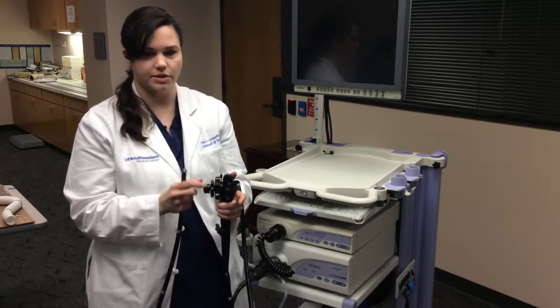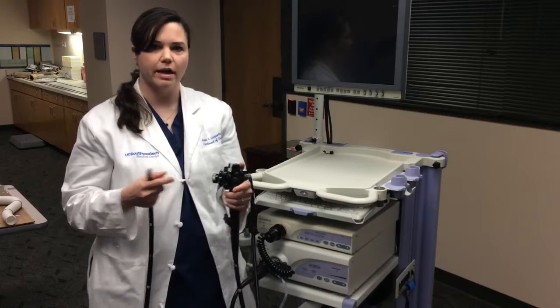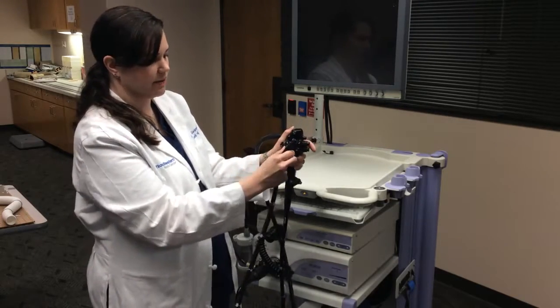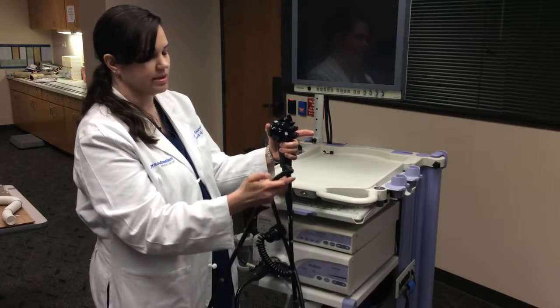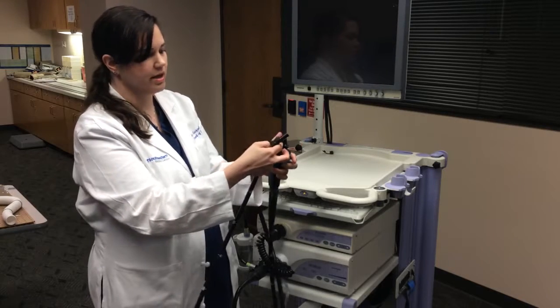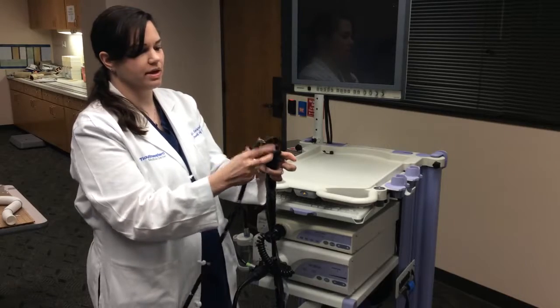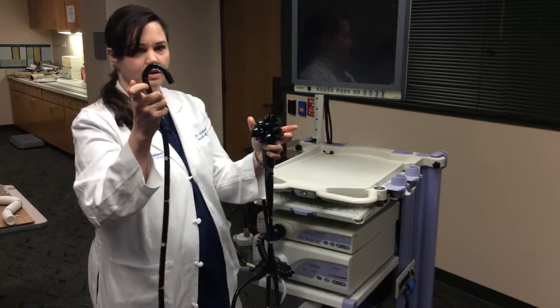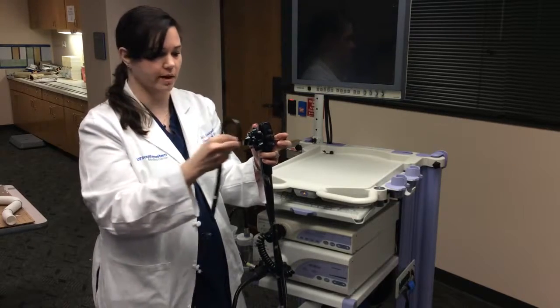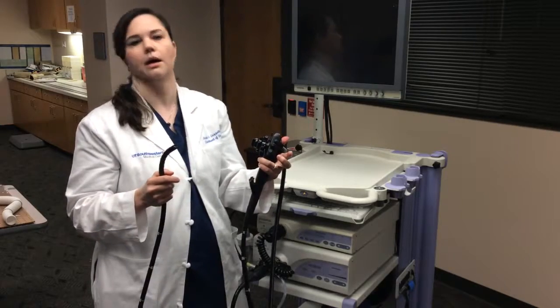The other thing that I like to do, especially with the models, because you're going to be doing a lot of maneuvering and you want to hold things in place, when you look at these little buttons that have the F on them, if they're all the way forward, this is going to be easily maneuverable and it'll snap back to its neutral position. If you put these F buttons back, it'll lock it in place. So you can actually rotate it all the way down and it's going to stay there. That may help you on some of your models if you want to try playing around with that. So that's a fully set up lower endoscopy ready to go.